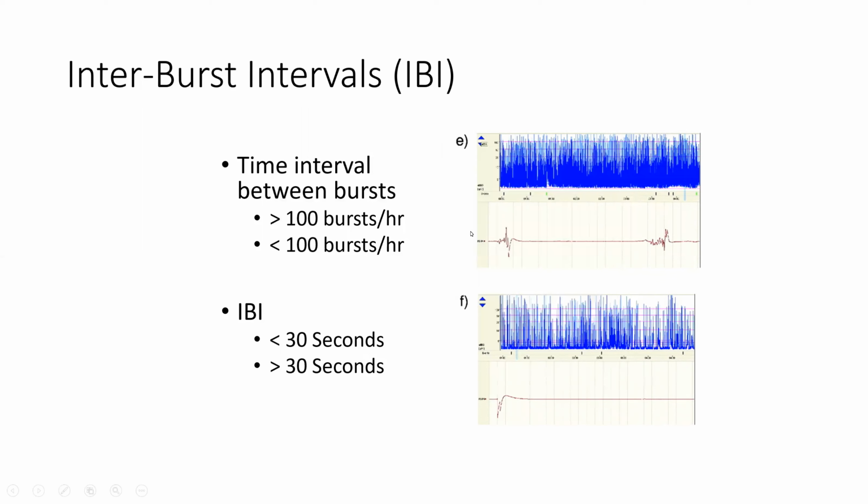And so you can see here where we have a tight, dense band. This is still burst suppression. You have a flat lower margin, you have bursting over here, you have a very thick bandwidth. But because it's so dense, that tells you that there's more activity, there are more bursts happening. So I hesitate to say that that's a better sign, but there's certainly more activity.